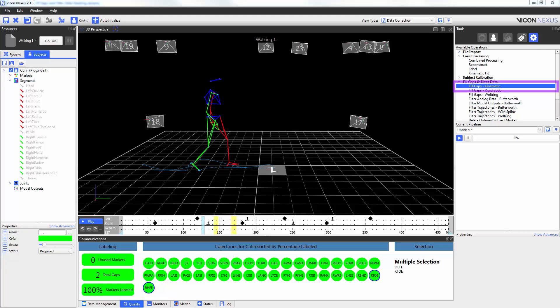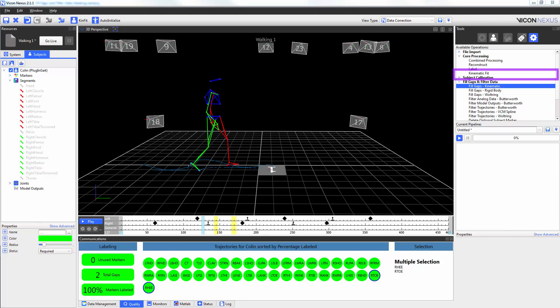The kinematic fill pipeline operation uses the kinematics of the segments to fill the gaps of markers that make up that particular segment. In this example here, I have gaps in my right toe marker and my right heel marker which both make up my right foot segment. In order to use the kinematic fill pipeline operation, we first need to run the kinematic fit. And this is found underneath the core processing available operation heading.